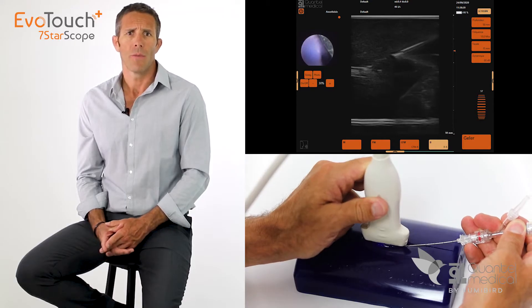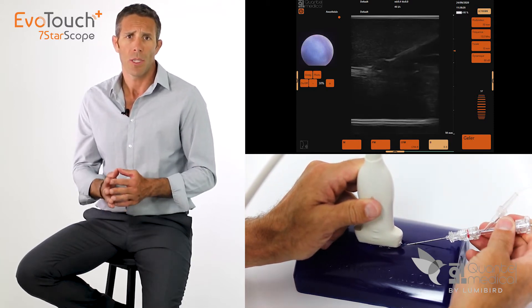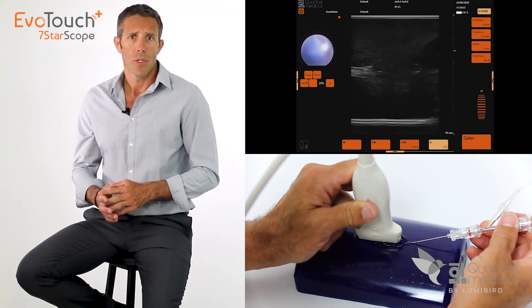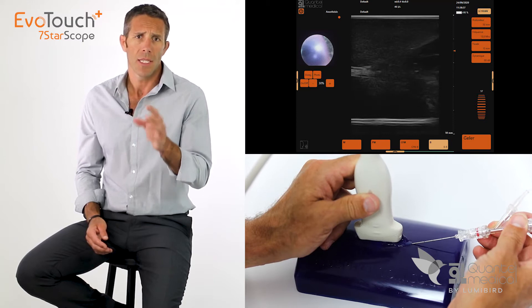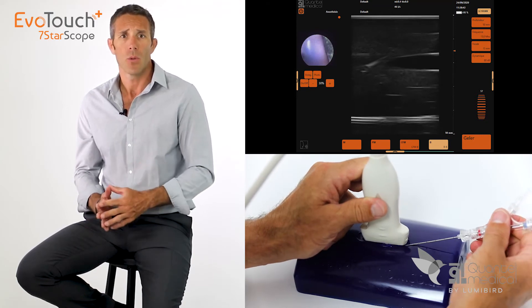After choosing the appropriate probe for the procedure to be performed, we will first use the high-resolution ultrasound image of the EvoTouch Plus to accurately follow the path of the cannula through the tissue. The image quality of the EvoTouch Plus will allow for a perfect visualization of the hyper-echogenic 18-gauge needle, following the path of the cannula through the tissue directly on the screen and without effort.